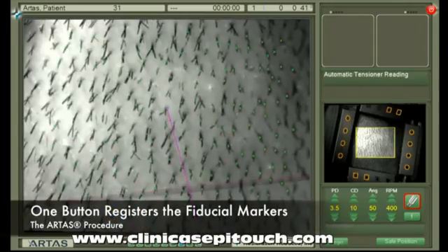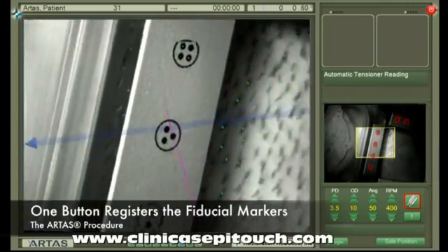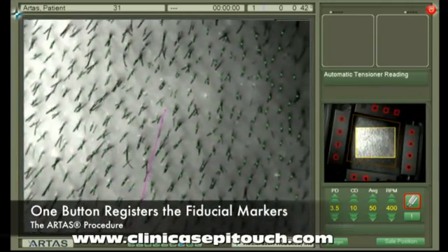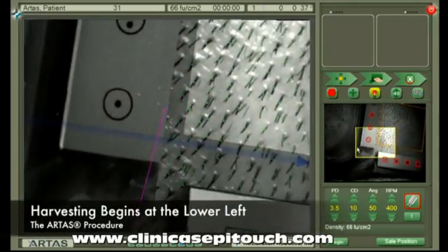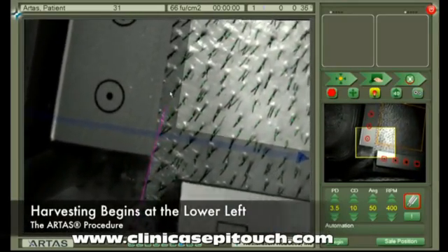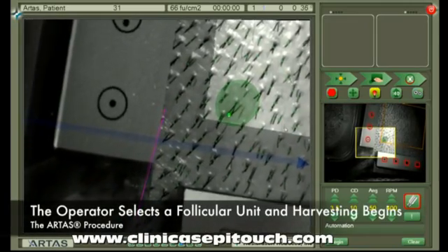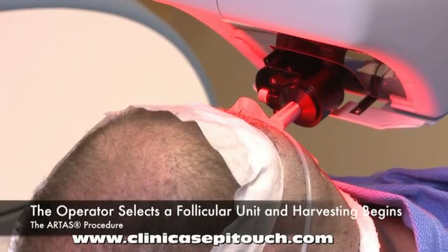With the touch of a button, the system will register the fiducial markers located at the edges of the skin tensioner. This process is key to the system's ability to track already harvested follicular units, as well as automatically select the next follicular unit to be harvested. After registration is completed, the system will position itself in the lower left-hand corner. The operator simply selects a follicular unit, and harvesting begins.